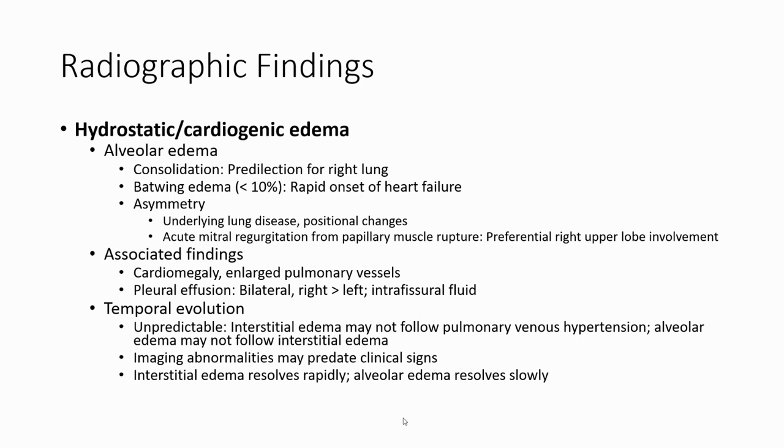unpredictable. Interstitial edema may not follow pulmonary venous hypertension. Alveolar edema may not follow interstitial edema. Imaging abnormality may precede clinical sign. Interstitial edema resolves rapidly. Alveolar edema resolves slowly.